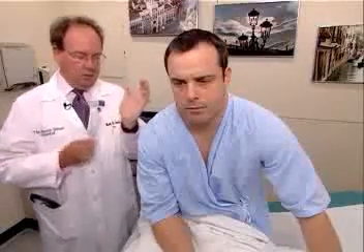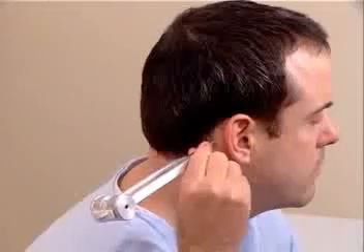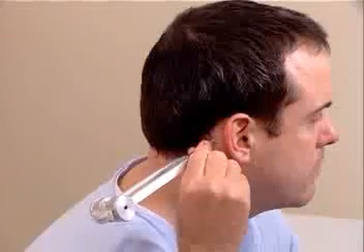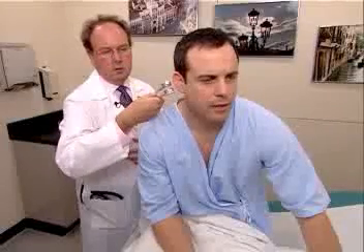I'm going to demonstrate the Rinne test first. Strike the tuning fork by placing it into oscillation by striking the heel of your hand, and then placing the vibrating tuning fork on the mastoid process of the patient. Mr. Johnson, do you hear or feel anything? Yes. Okay, tell me when you stop hearing it or feeling it. I stop. Okay, what about now? I can hear it. Okay. So air conduction is greater than bone conduction, and that's normal — AC greater than BC.